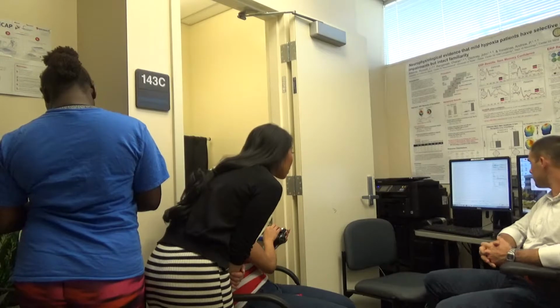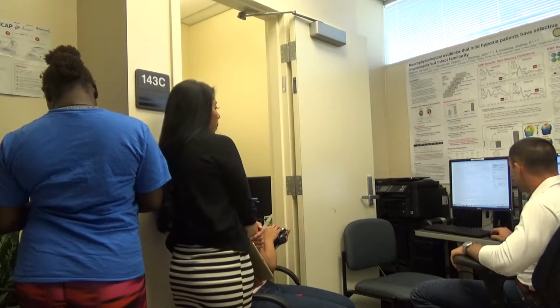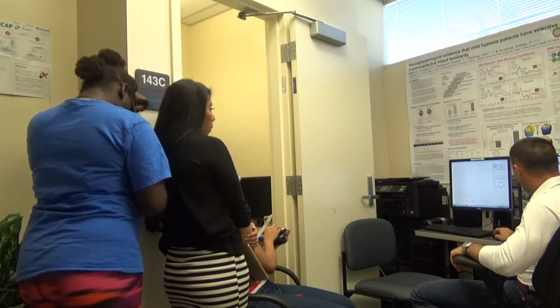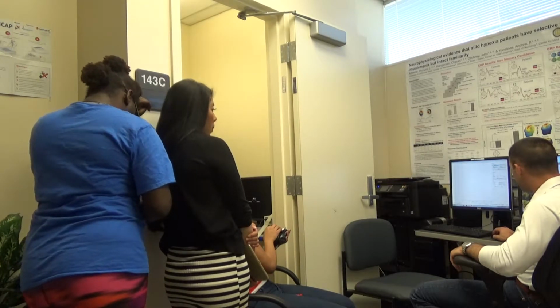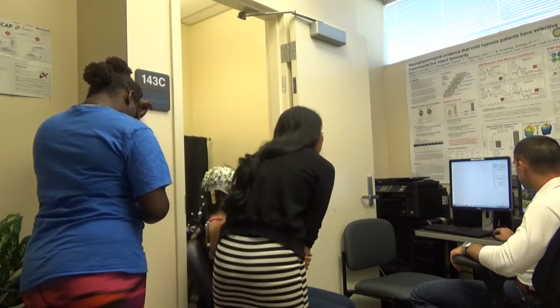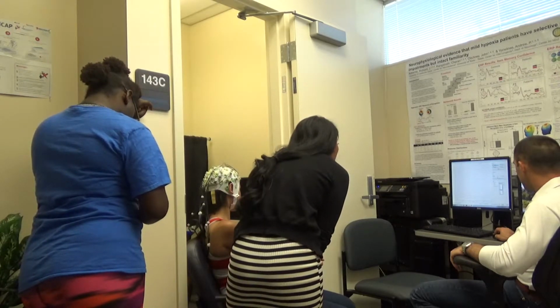Is that seconds, right? Yeah, so every one of these vertical lines is a second. We can make that more, let's say 5 seconds like that. See? Let's come right back up here.